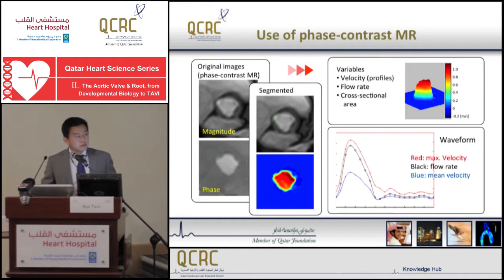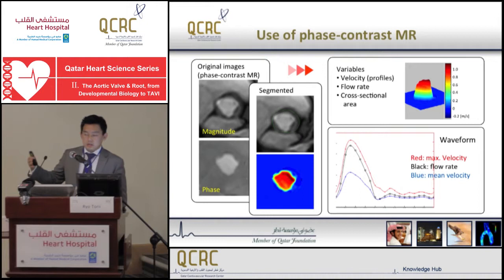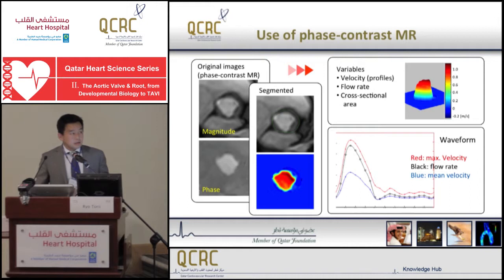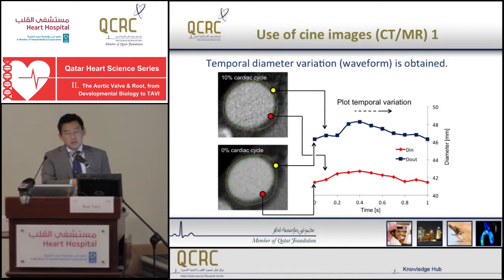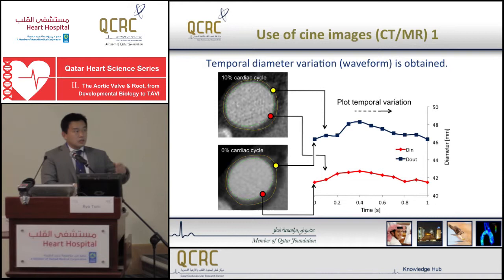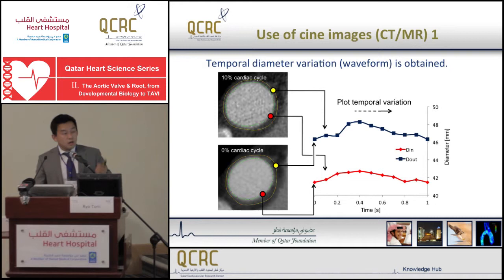Because the data is given as a time series, we can reconstruct how the flow develops in time — or velocity development in time. As this is time-dependent, we can also calculate how the radius or diameter — or cross-sectional area — changes in time. The delineated lumen boundary and outer boundary of the aortic root cross-section show how the calculated diameter changes along the cardiac cycle. It dilates the most in the middle of the cycle, corresponding to higher pressure at that point.